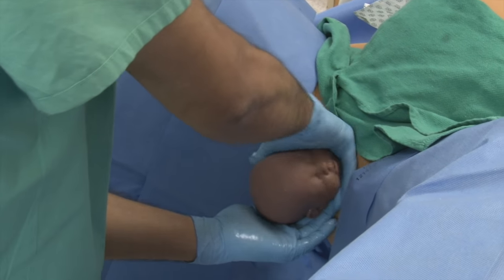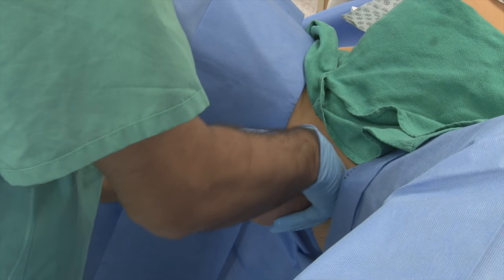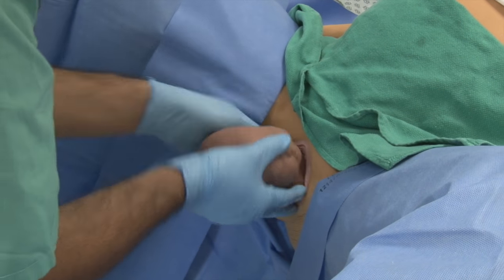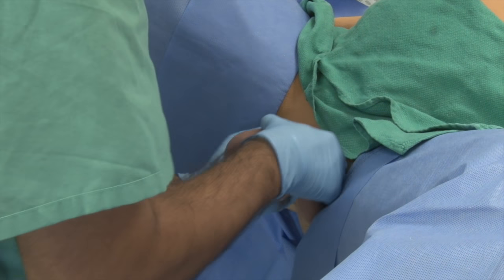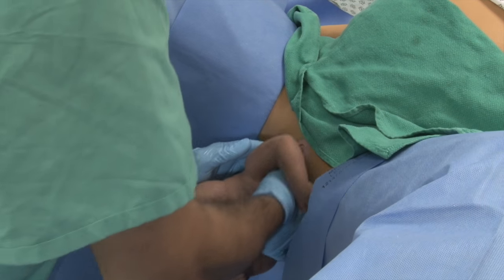Push, push, push, push, push. As you're coming in with the baby, there's your elbow. Take that elbow to the right, then get the other shoulder. I don't even need — I have to look at the count. That hurts first — yep, set me up.